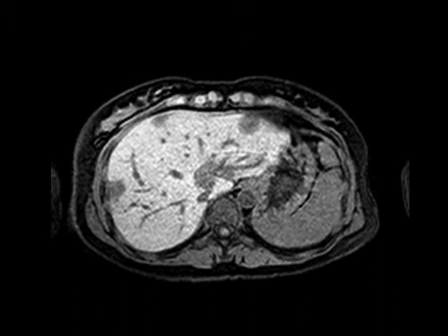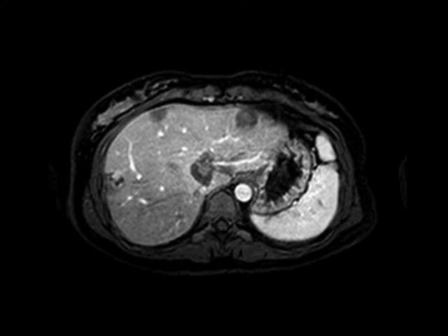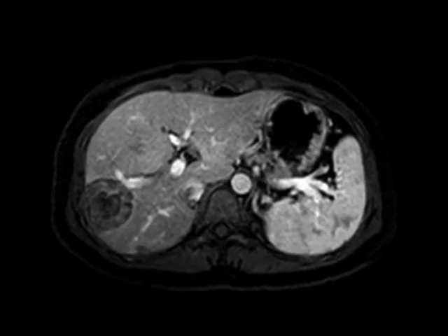Here's one of my favorite diagnoses in all of hepatic imaging. On these MR images, you can see that there are multiple relatively T1 hypointense, T2 hyperintense, ring-enhancing lesions along the margin of the liver. At each of these sites, there's very subtle capsular retraction. And if you look carefully, both on the T2-weighted images as well as the T1 post-gadolinium images, each of these lesions demonstrates a characteristic ring-like morphology, also known as a target morphology — most apparent in the largest lesion in the right hepatic lobe.